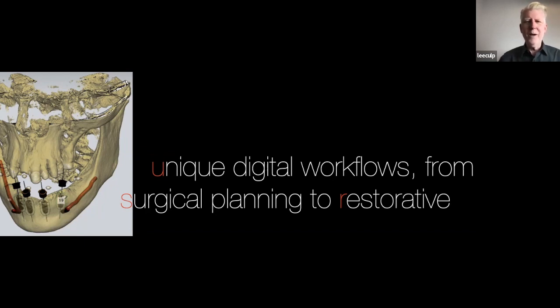So it finally came down to, and this is a generalization, I mean, this is not exactly why we do all those things in dentures, but there's so many things we do in dentures, from the shapes of the teeth to the positioning of the teeth to the design of the denture, because dentures never fit. So we do things that aren't natural and anatomical because they never fit, and we had to compensate for a bad fit. So I'm like, well, they fit now.